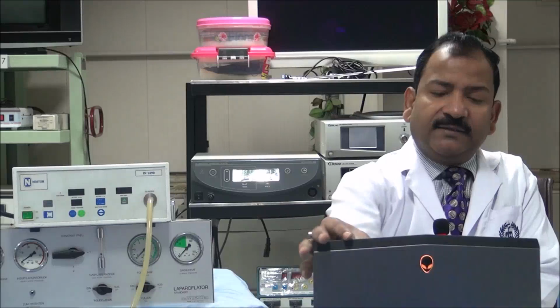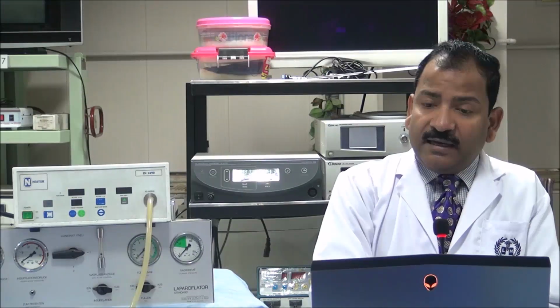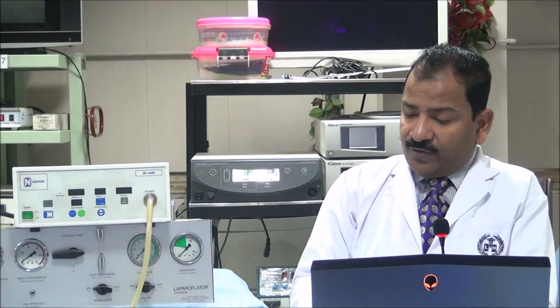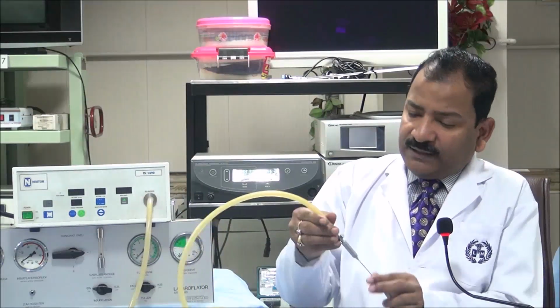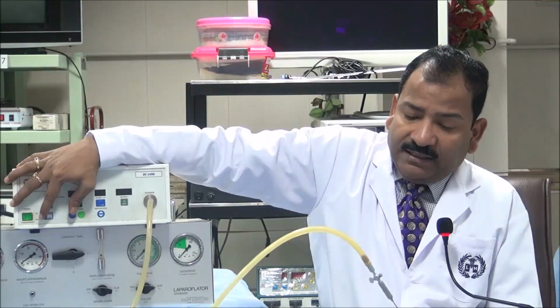Suppose this is a Veress needle and I have attached the Veress needle. After pushing and attaching the Veress needle, I have attached the tubing, and then I am switching the insufflator on.